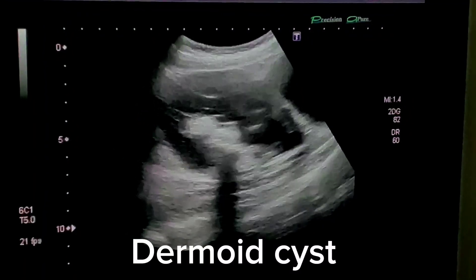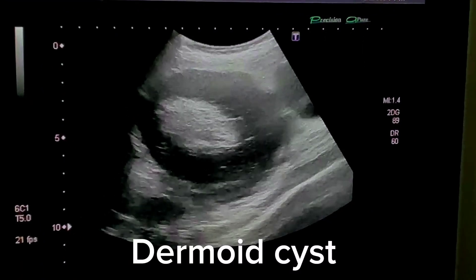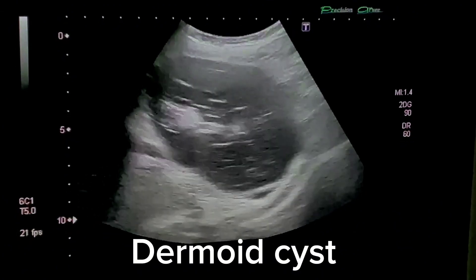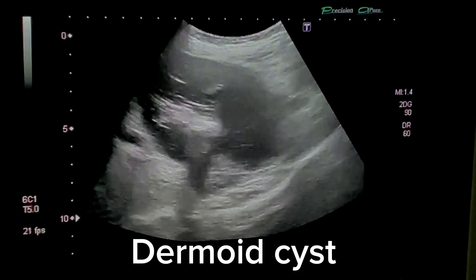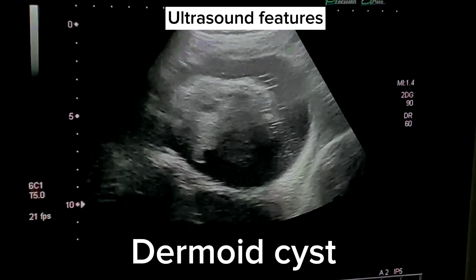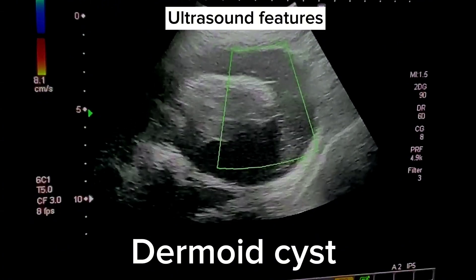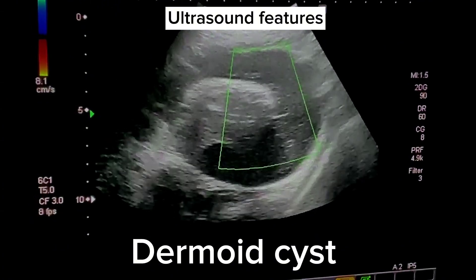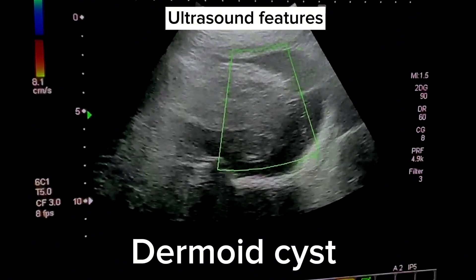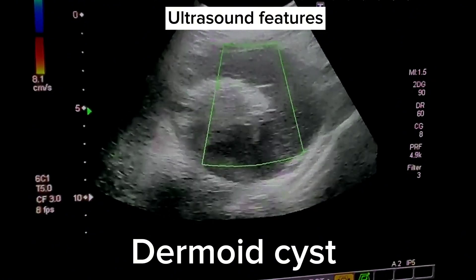A dermoid cyst, which is a mature cystic teratoma, has typical features seen on ultrasound. It has mixed echogenicity and contains fat, hair, teeth, and other tissues, leading to a combination of hyperechoic (bright) and hypoechoic (dark) areas.